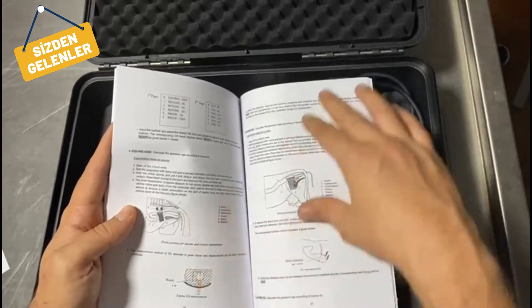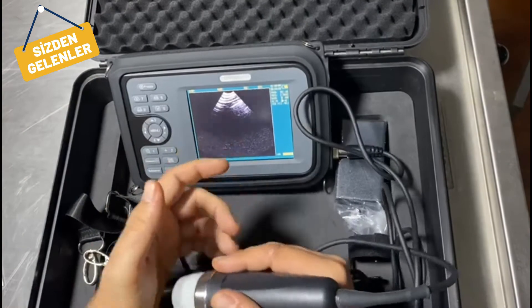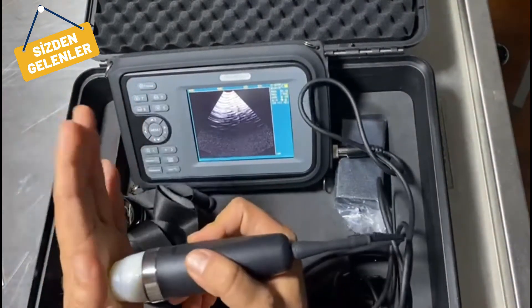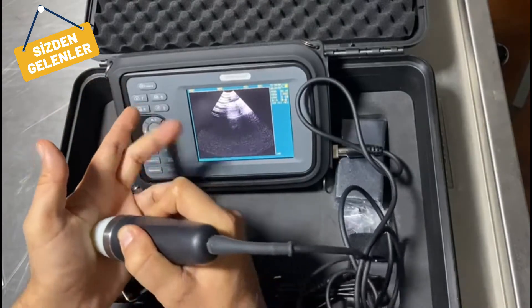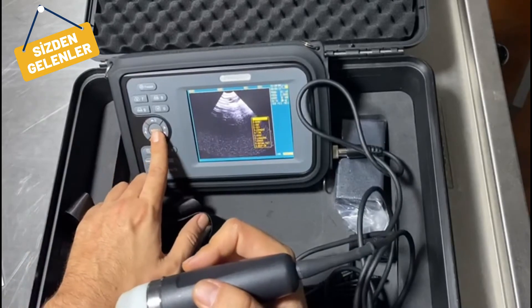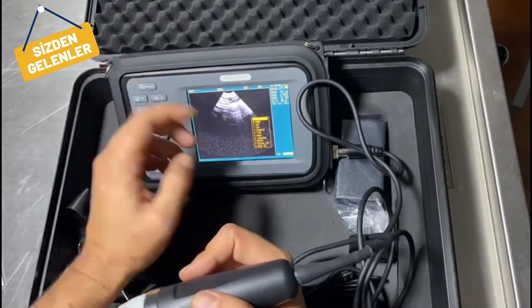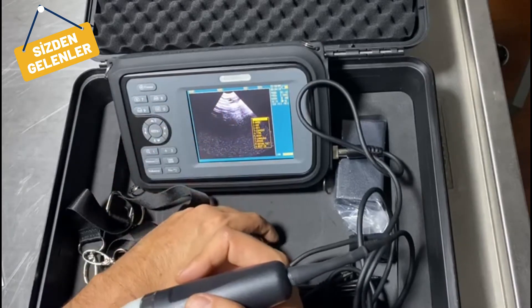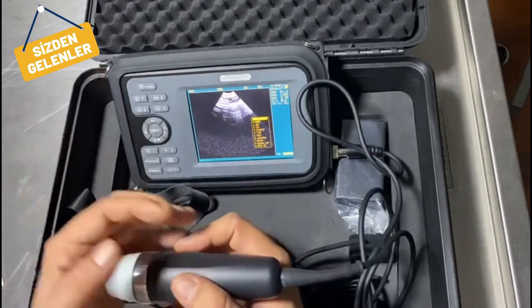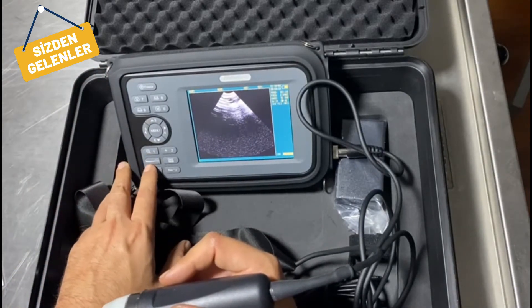In B-mode, when we freeze, you can enter the menu where you can enter the patient's name, age, sex, and comments. You can also change the language, erase data, or move on. And in this menu you can also go for measurement.